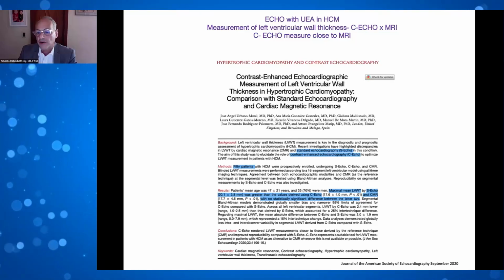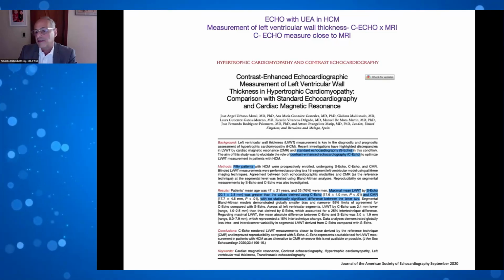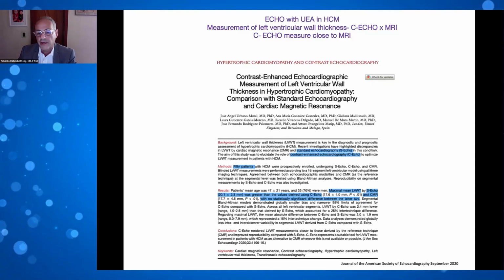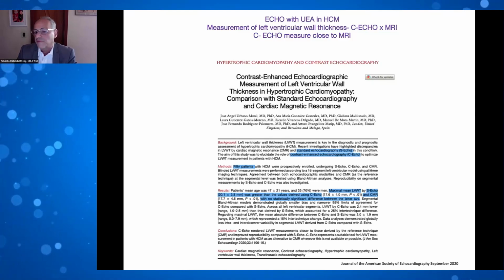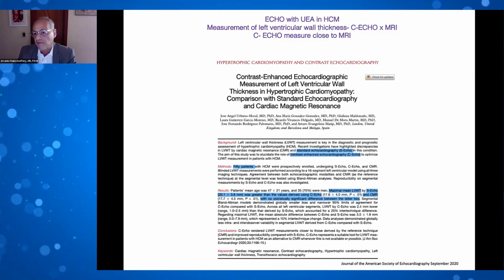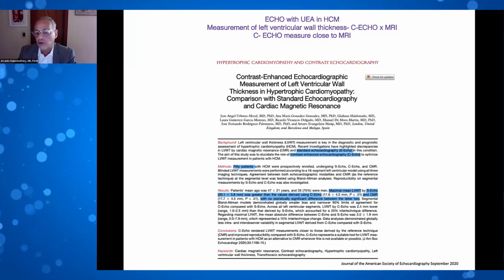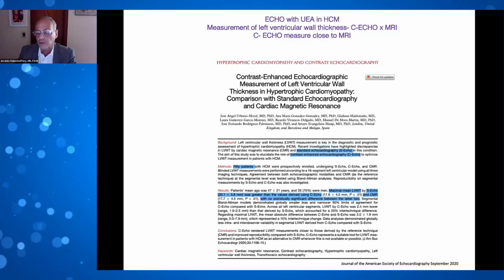Now, in the majority of cases they are the nurses. We train them, and then there is no problem. In 5 minutes, if the patient is an outpatient, they have the access and they inject. So it worked very well. We don't have a problem to do that.